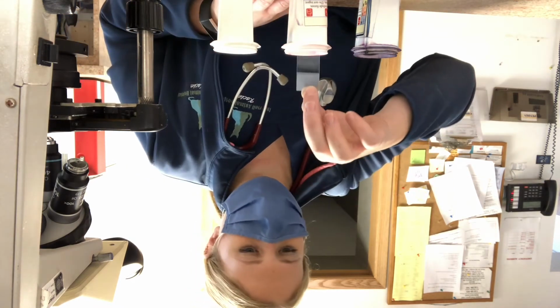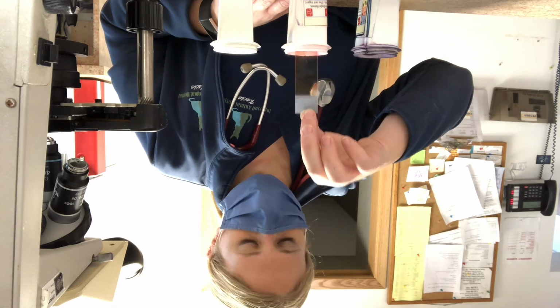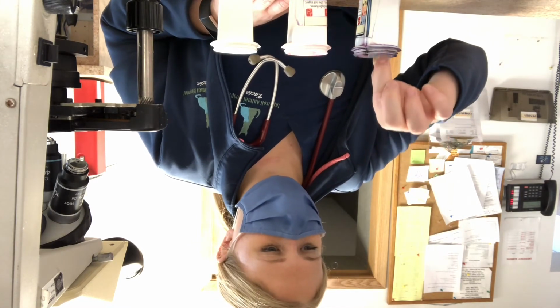And then into the red. And then into the purple.